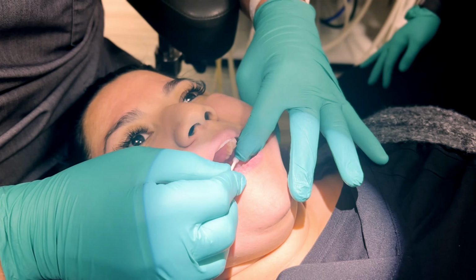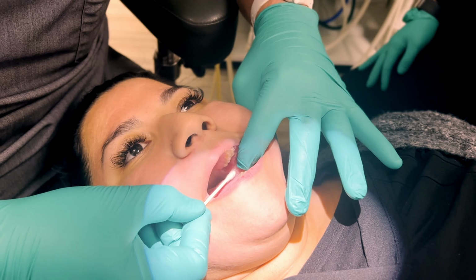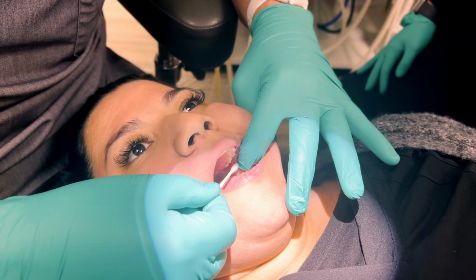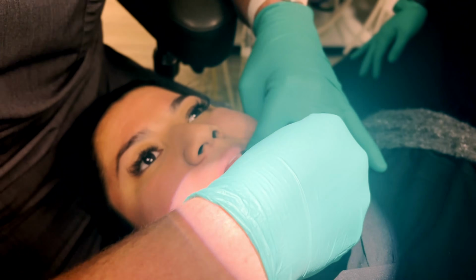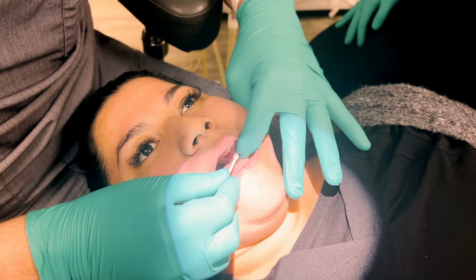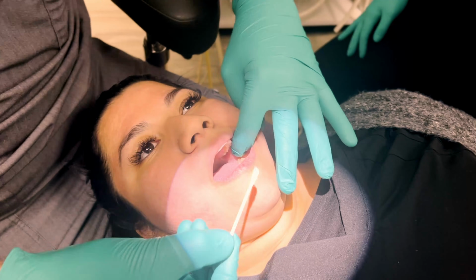However, you don't usually see that. So I like to use the indirect technique. How we do that is we're going to pull her cheek back, and we actually go in this direction here and try to hit the bone. Once you hit the bone, you're then going to walk it along this way, and you actually get around the lingula, and you'll feel it drop, then bring it back to where the canine is and deposit the rest of it. The other thing is the injection points for the IA and the Gow Gates are slightly different.